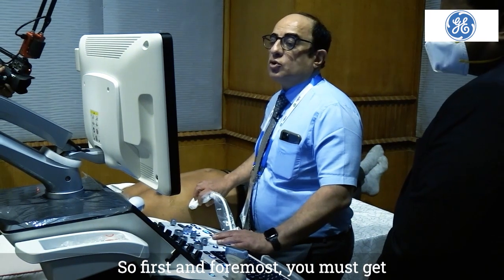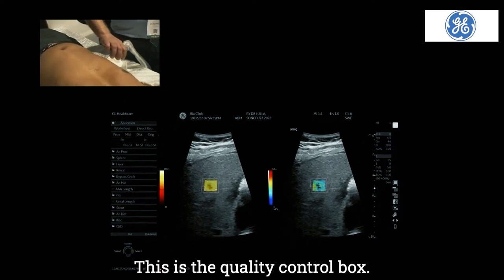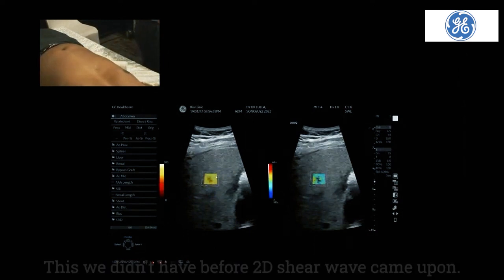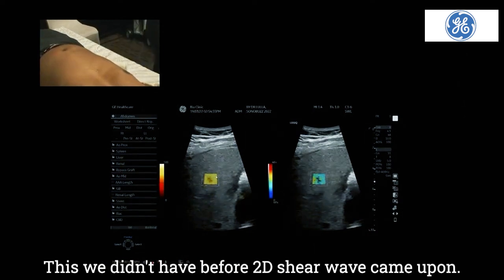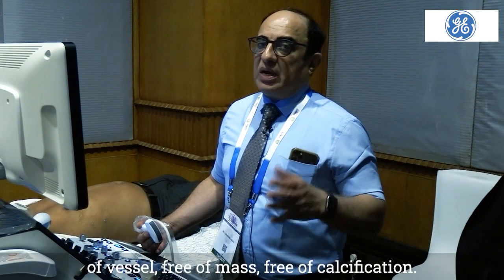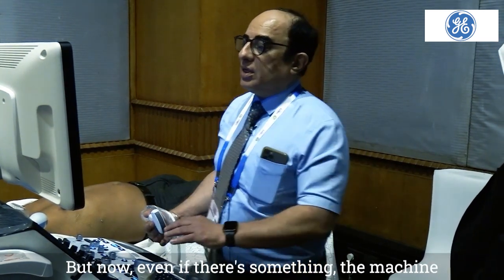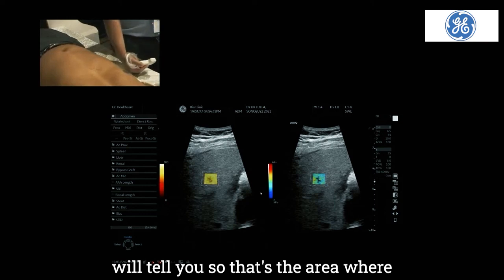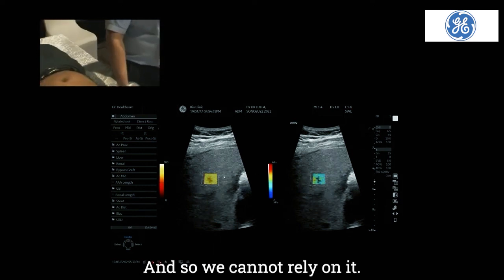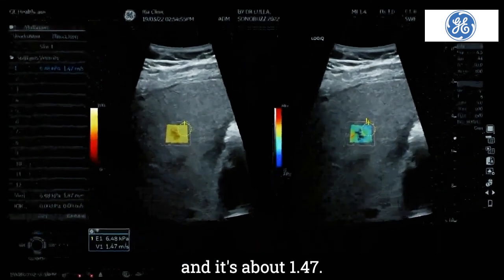So first and foremost, you must get a homogeneous yellow in the box here. This is the quality control box. If it's homogeneously yellow, it tells us that the shear wave can be relied upon. This we didn't have before 2D shear wave came upon. Initially, we would just select an area free of vessel, free of mass, free of calcification. But now, even if there's something, the machine will tell you. So that's the area where you see there is a dropout. You're not going to get a shear wave activity out there. And so we cannot rely on it. So you take it from here somewhere, and it's about 1.47.